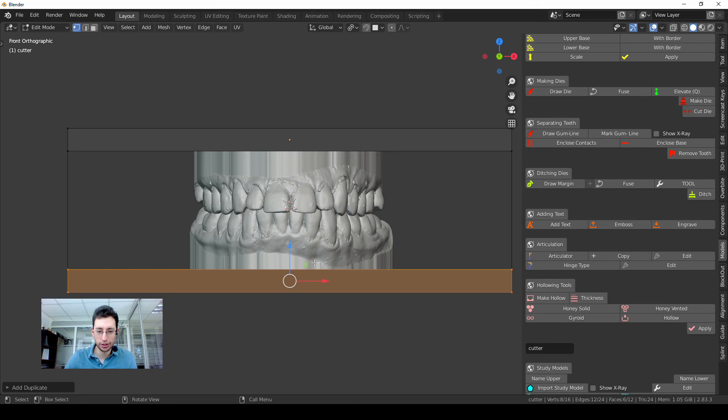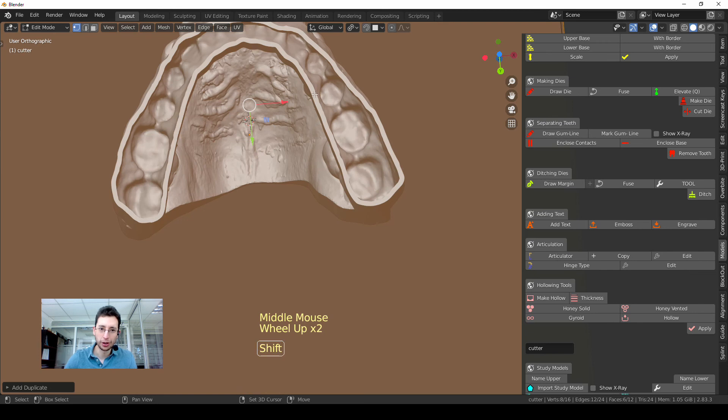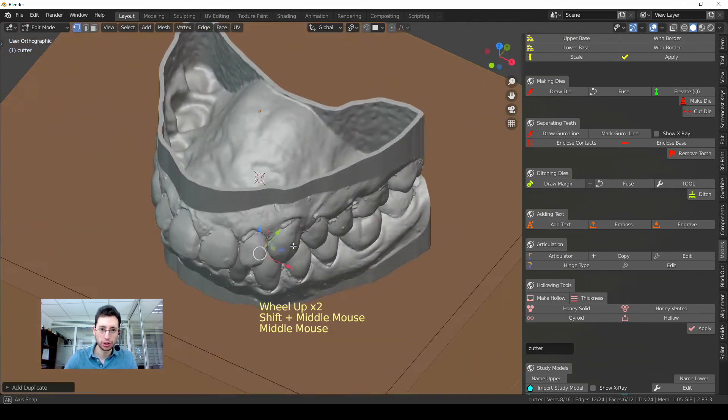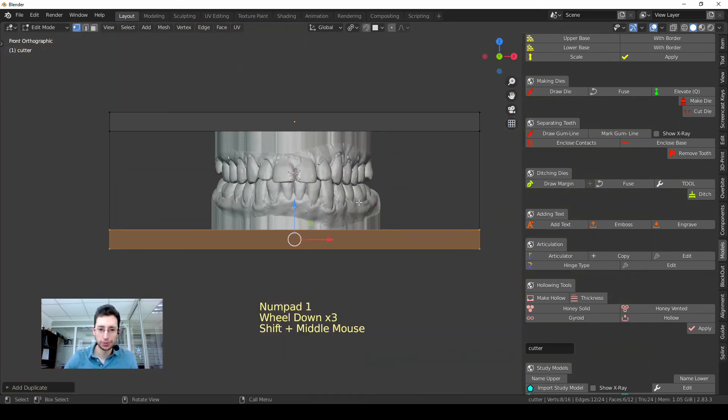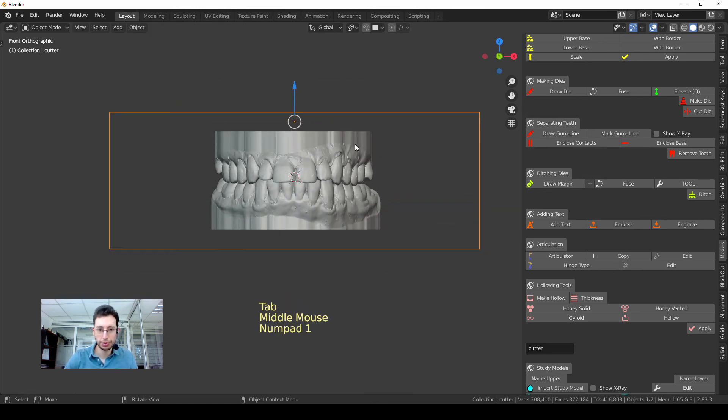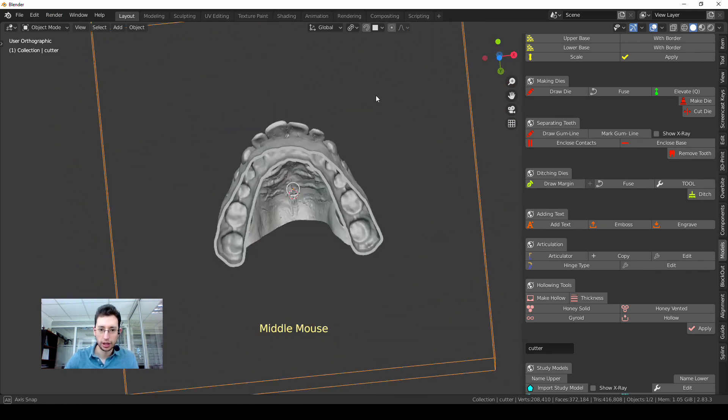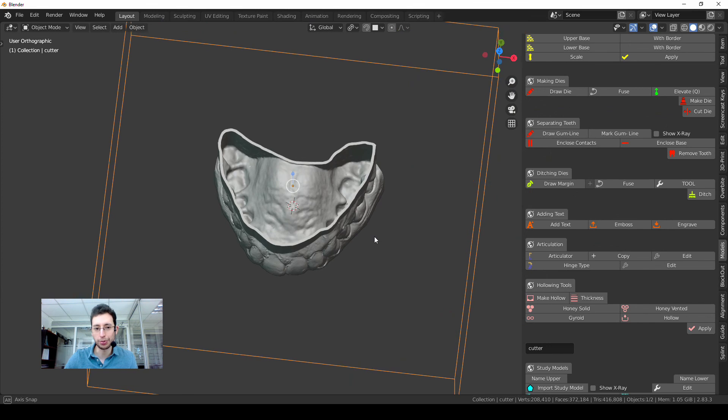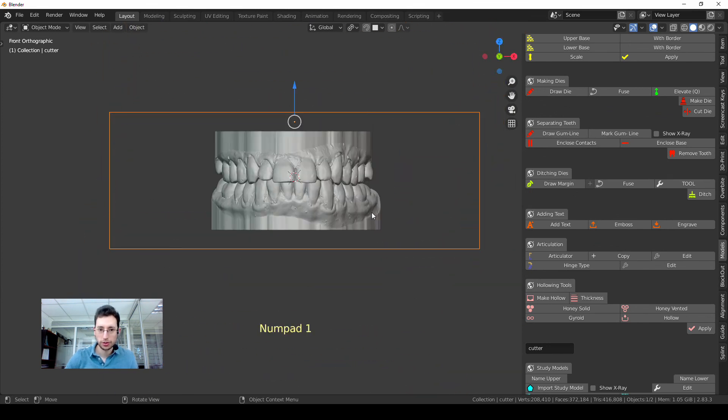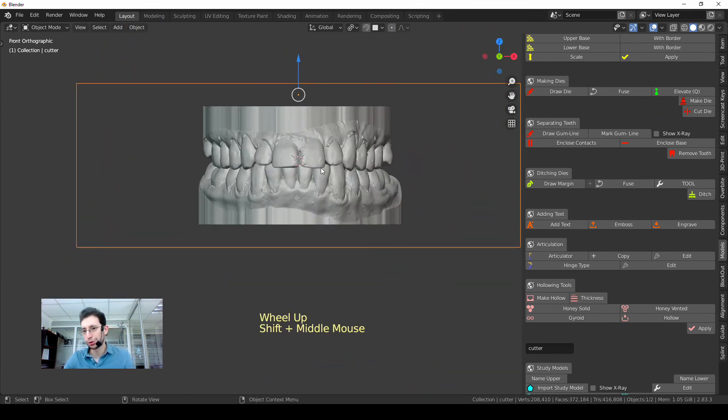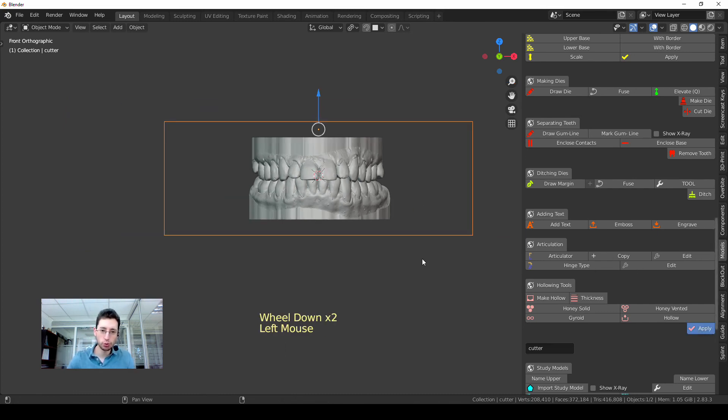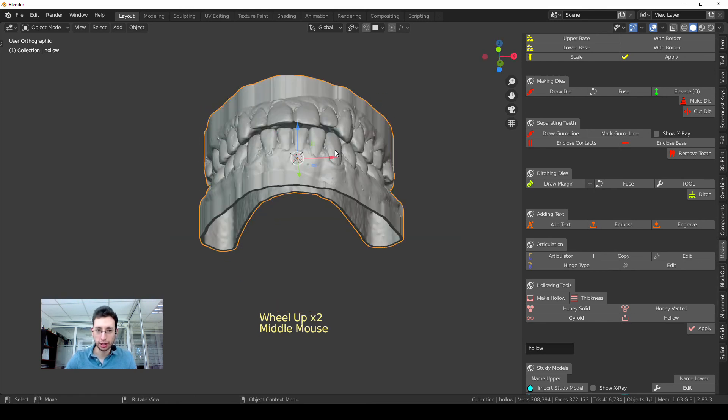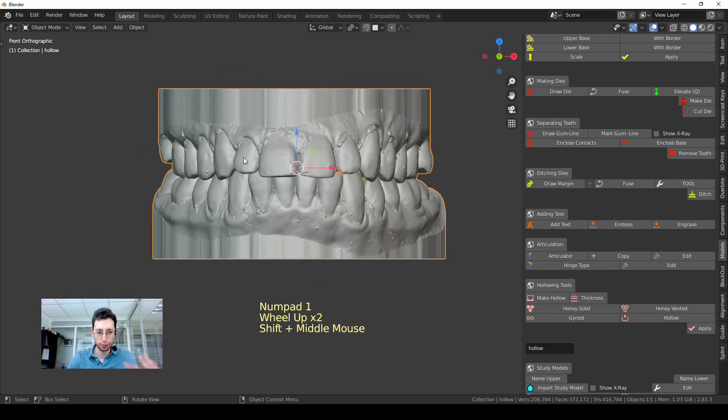So now as you can see, the lower model is also hollow. Good. So if I'm happy with that, I press Tab again going back to Object mode. You can see here, and I am watching a preview of the final hollow models. So now the only thing I need to do is to press Apply and we are done. The models are hollow.